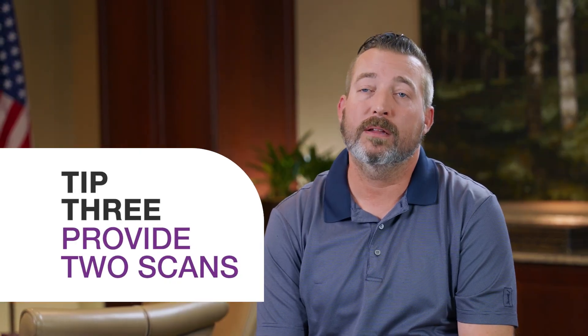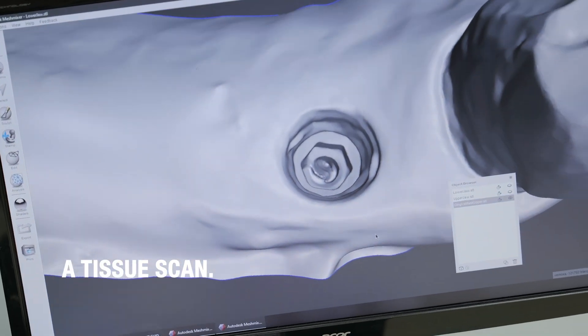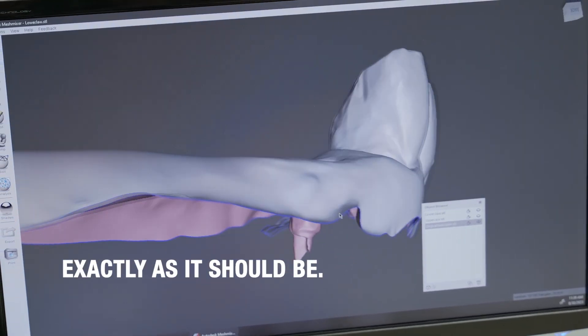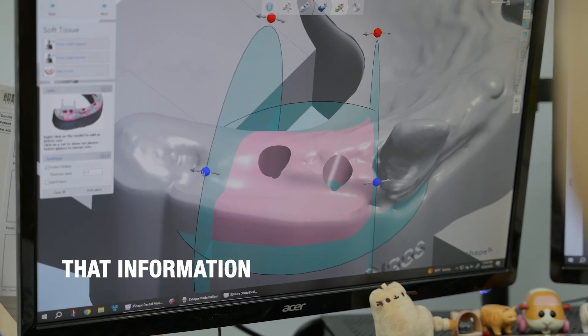Tip number three: you're going to need to provide two scans. The first scan is going to be a tissue scan. This is going to make sure that we have the emergence profile exactly as it should be. Minimal displacement, normal displacement — that information is going to be critical so that you're not forcing a crown down.